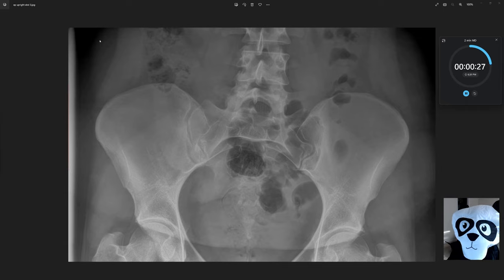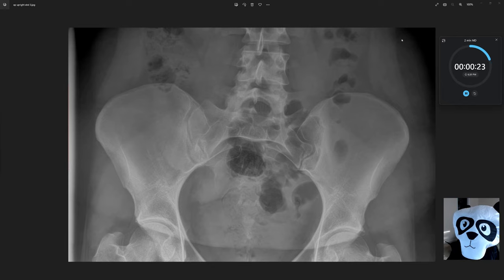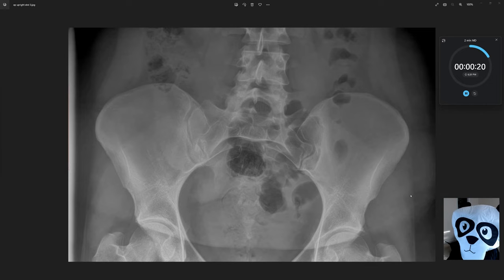Last but not least, we want to take a look at the external soft tissues and again make sure there are no defects. They appear to be normal here.